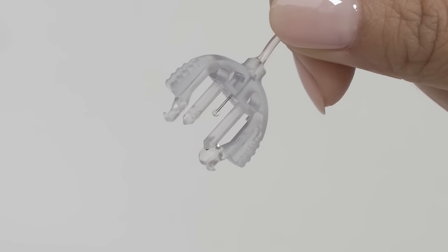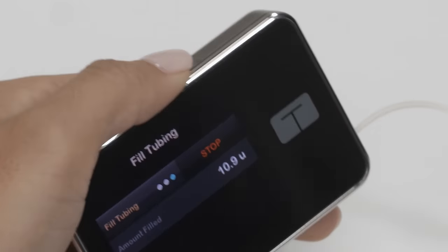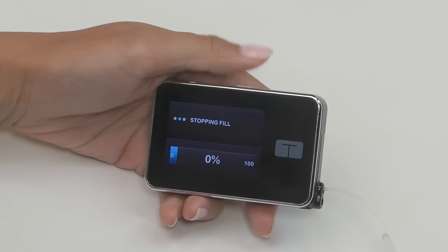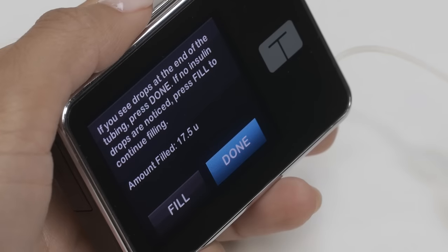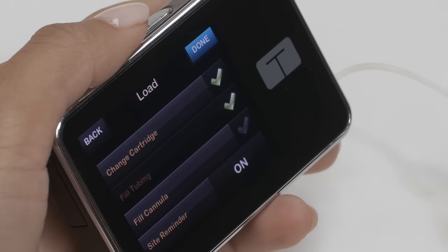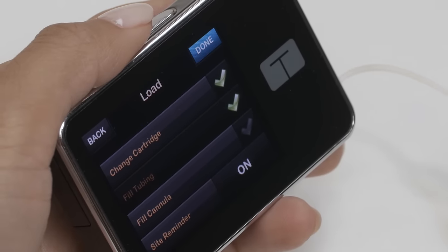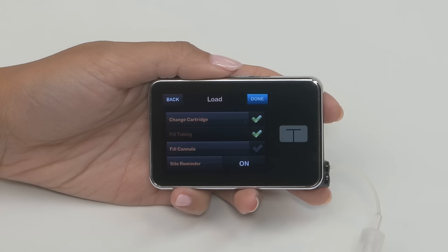Once you notice three drops come out of the end of the tubing and you're satisfied that there are no large air bubbles left, tap stop. Your pump will ask you to confirm that you saw drops at the end of the tubing. If you saw drops, tap Done. If you stopped the fill process before you saw drops, tap Fill to continue.